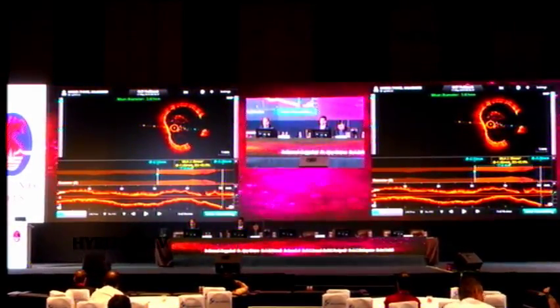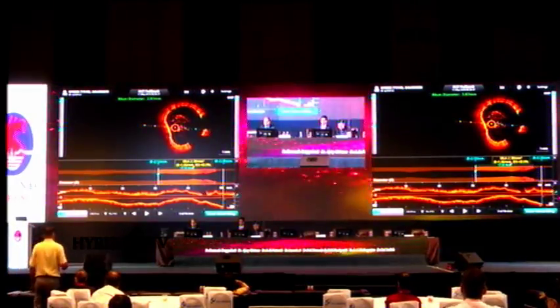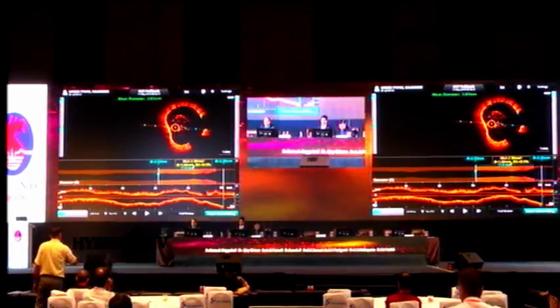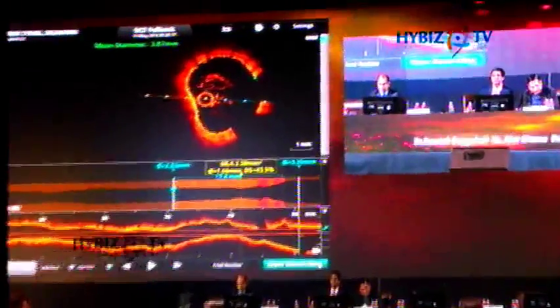Okay. So what we do is we take a 3.5 stent, stent it, and then dilate with a 4 millimeter balloon near the left main. Is it okay? And then do the OCT and check. Okay.